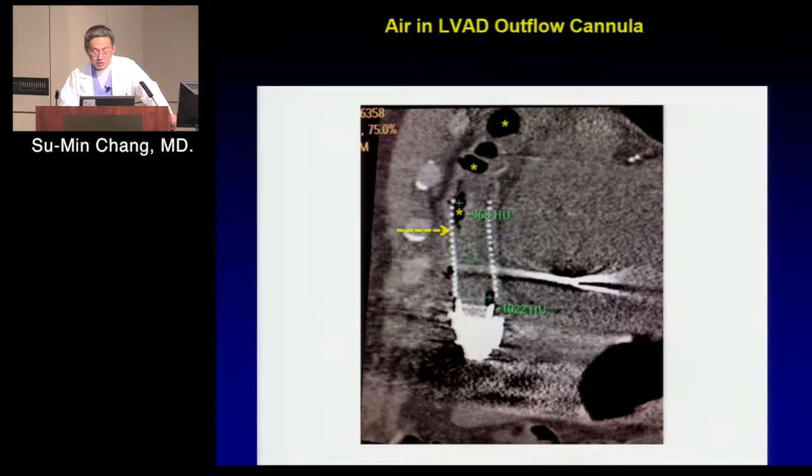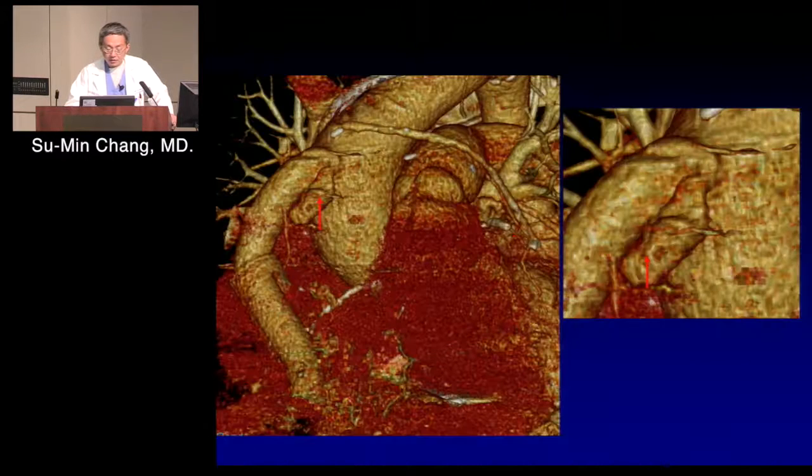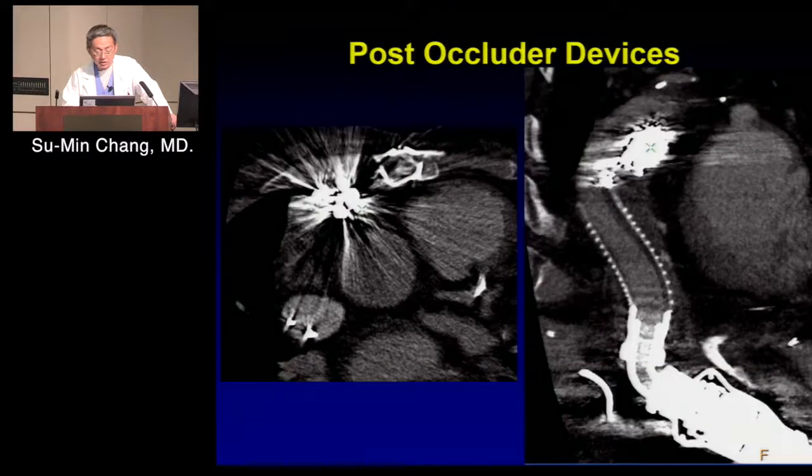And this is again the patient with air in the system, and this is another rare complication we've seen, a recurrent bleeding from the driveline site. The outflow cannula anastomosis site has a little pseudoaneurysm, as you can see there. And this is a 3D depiction. Again, we've seen this only in one case. And the vascular surgeon went in there and put in a bunch of occluder devices. I don't know, Jerry, did it work? Not really. Oh well. But after they put it in, there's no way to assess that pseudoaneurysm anymore. Okay.